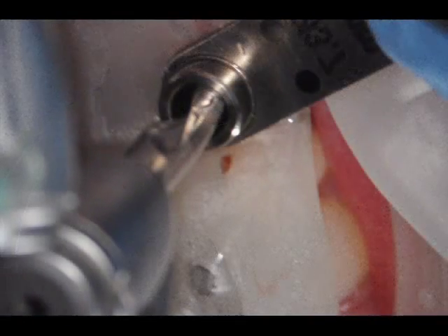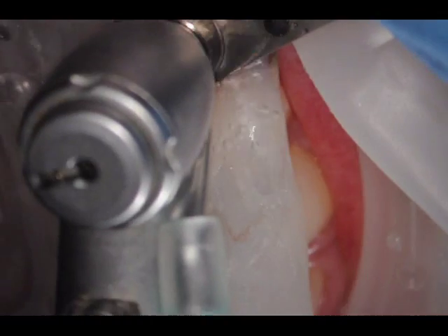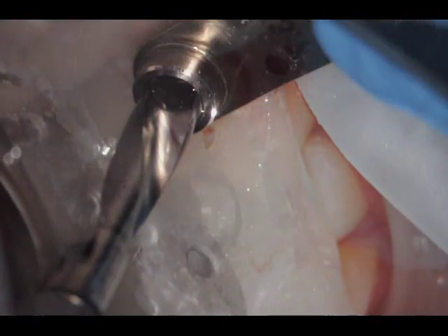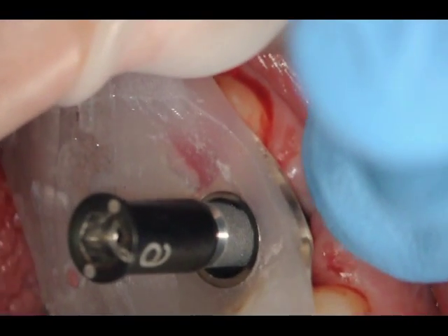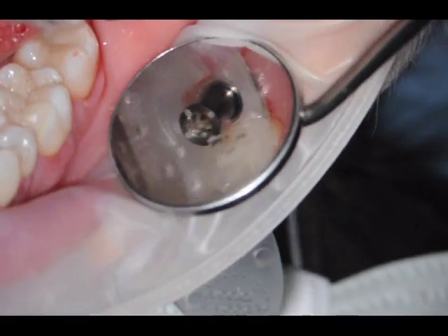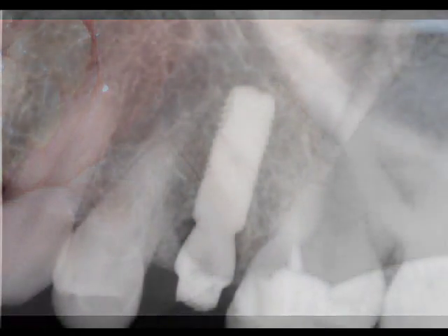Here's the surgical stent I mentioned earlier. There's a little sleeve in there. This surgical stent sits perfectly on the patient's upper jaw, and that sleeve is exactly where I placed it. I follow the drills in sequence — that stent guides me in terms of exactly where I want the implant to go. As soon as I've created the space for the implant, I'll go ahead and load the implant into the site. We'll use the driver to place it down flush to where we want it to go.